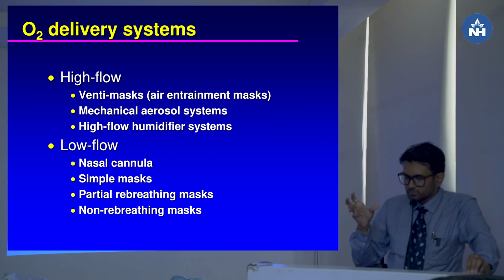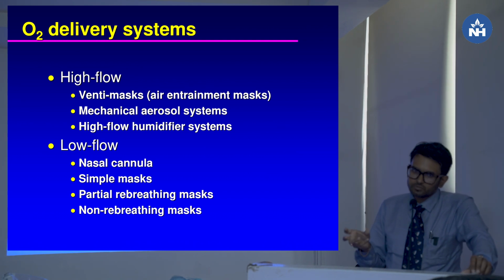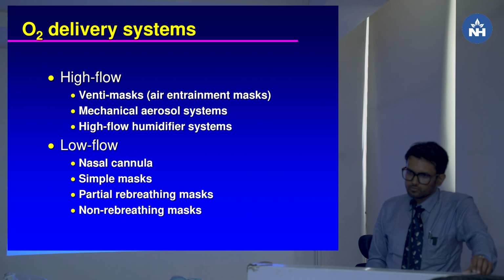This is just a schematic and informative description of the individual instruments and their merits and demerits. But clinically we have to judge the patient as per the clinical scenario, as per the arterial blood gases, PO2 level, PCO2 level, and accordingly we have to plan.